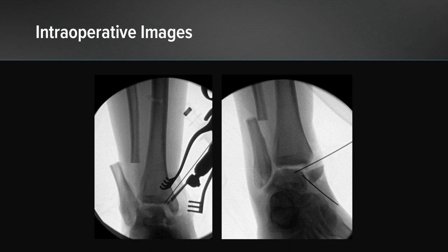Here we see the fibular osteotomy performed after already preparing the fibula for the nail. This image also shows the osteotomy of the medial malleolus being performed concurrently.